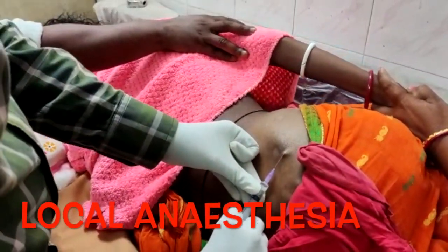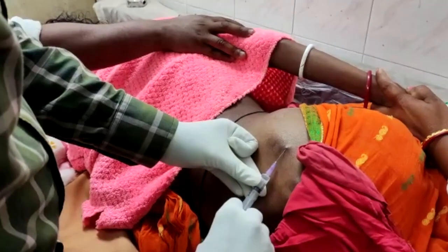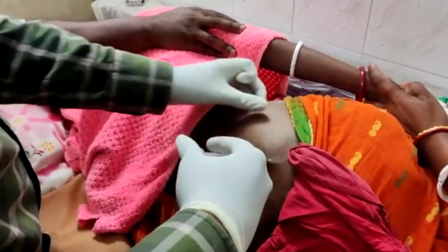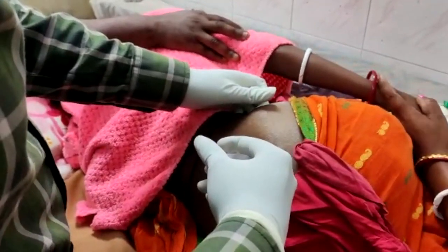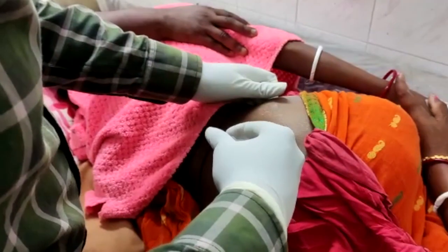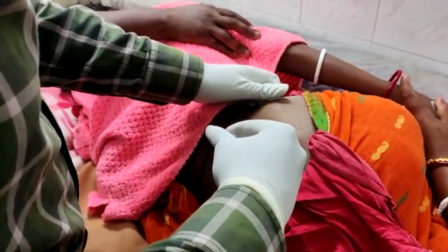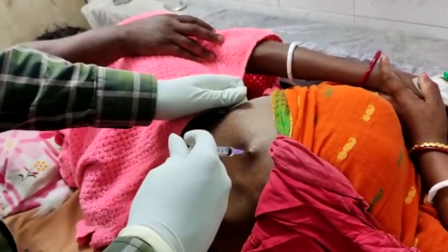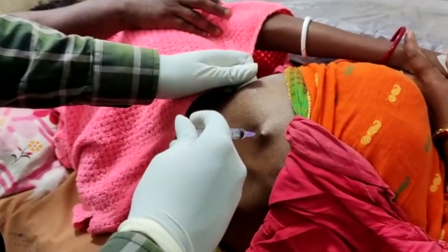Very importantly, before infiltrating the periosteum, we first infiltrate the skin — the dermis — as you can appreciate here. Once you infiltrate the dermis, there will be a bulge over the skin. Now we are infiltrating the periosteum with the local anesthesia, as you can appreciate in this video.